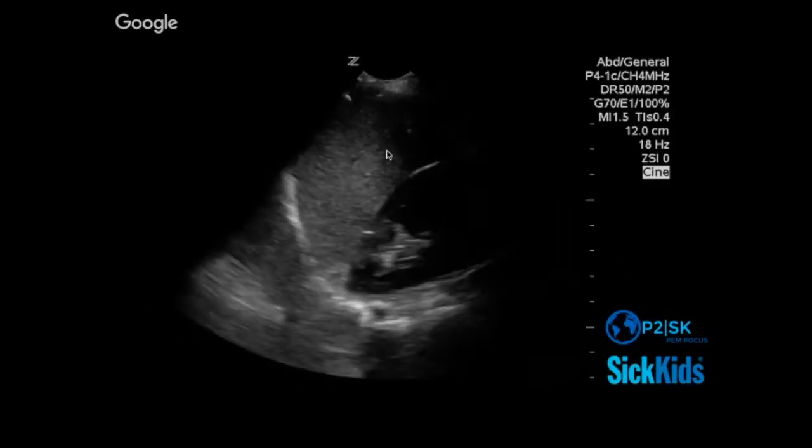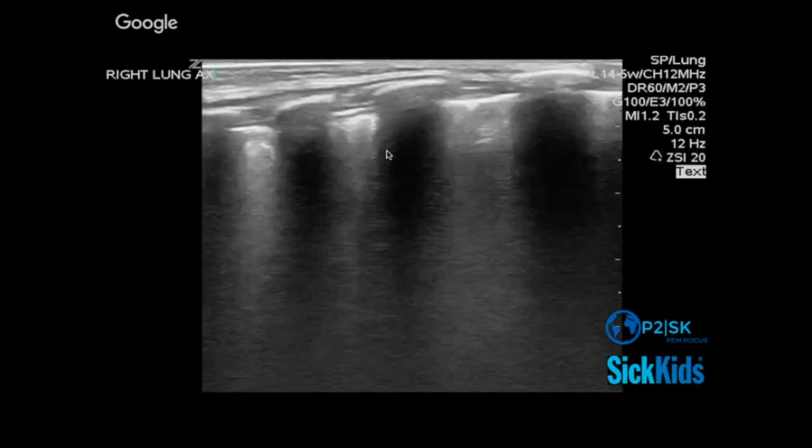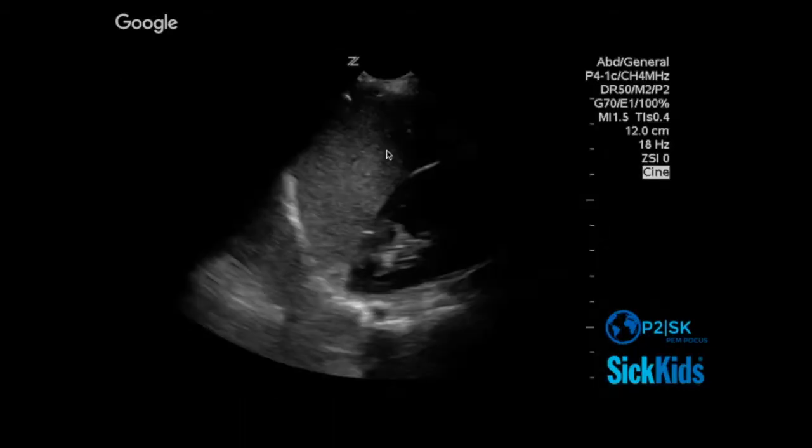What about my right and left upper quadrant views? Do I see any pleural effusion? Just in this static shot. Here's my spine. No extension, right? I wouldn't be surprised if I did see them. Pleural effusions are super common in people with CHF, right?